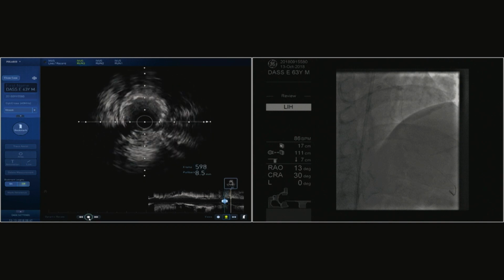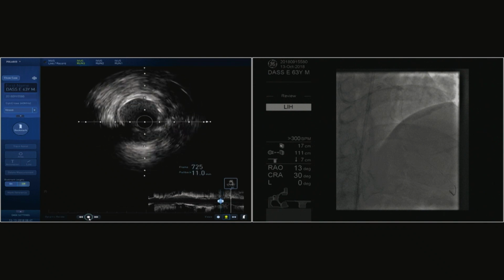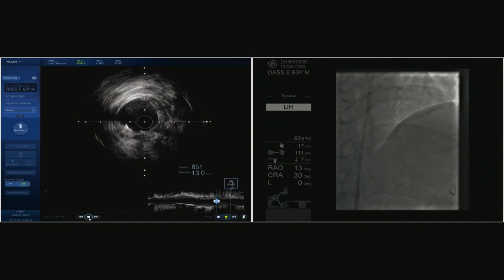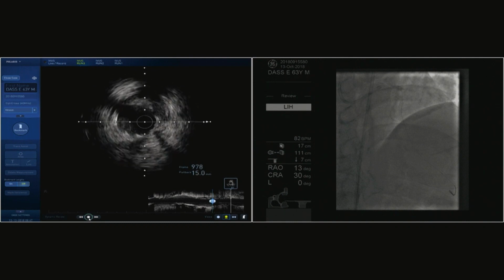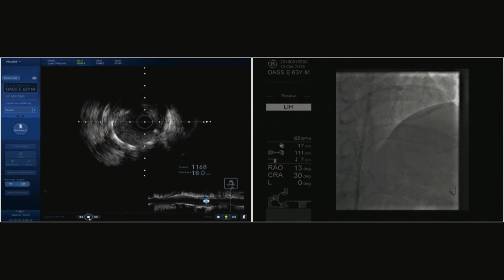What is the size at the distal edge of the stent? What is the lumen area? It was around 2.6 around there, and we have landed it at 8 to 10 atmospheres, which brings it to its total expansion in a normal artery. There was no plaque there, and the only thing is the proximal mid-segment needs a little further expansion.